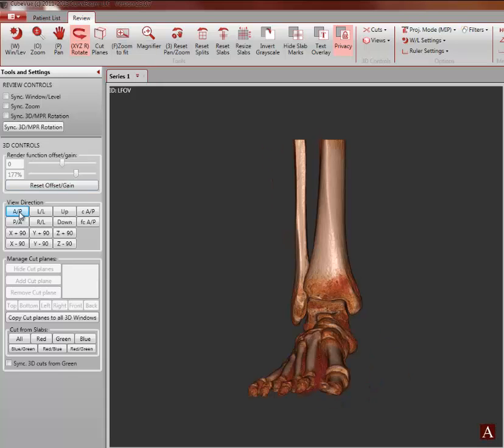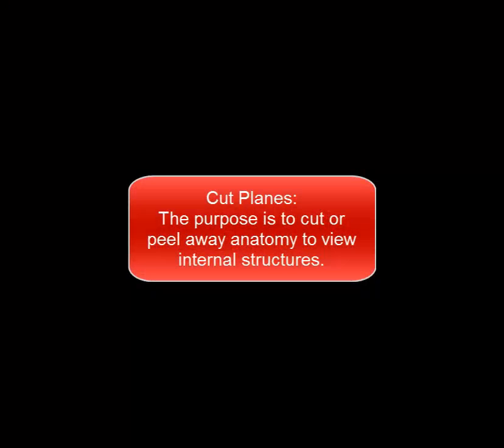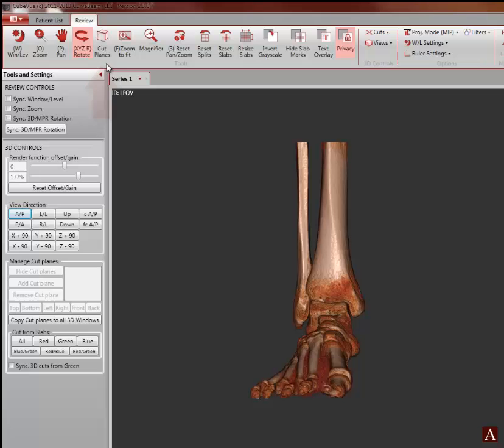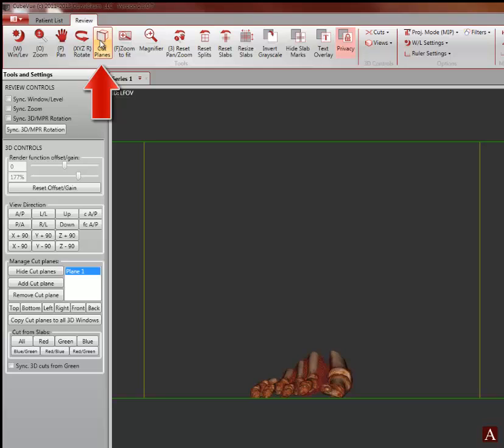Next we will discuss the cut planes tool. The purpose of the cut plane is to peel away anatomy in order to view internal structures. To enable cut planes, click on the cut plane button on the main menu bar.